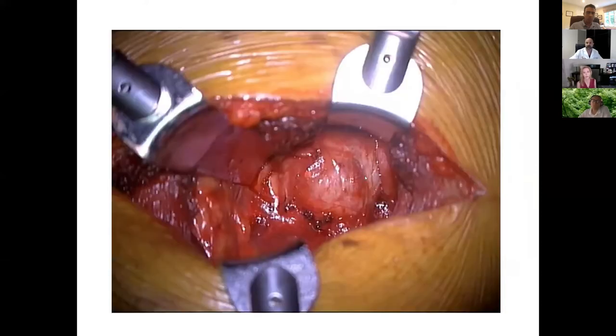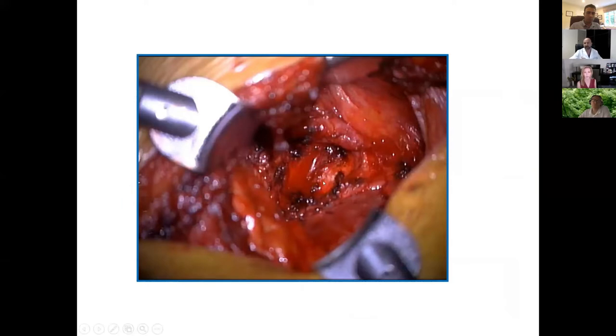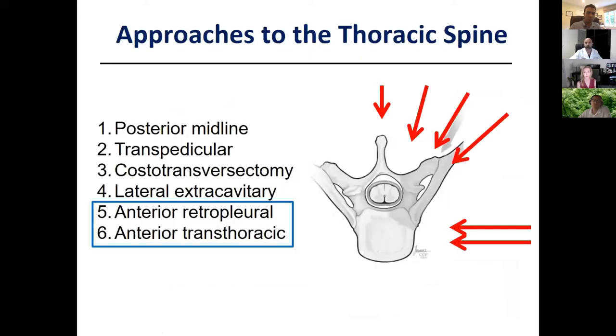So this is the lesion. Jonathan is absolutely correct. I did this with an access surgeon, a mini open incision laterally, and this is the schwannoma right here, superimposed on the anatomy, and it came out very nicely. But having an understanding of where it is in relationship to the pertinent structures is, in my opinion, very important.